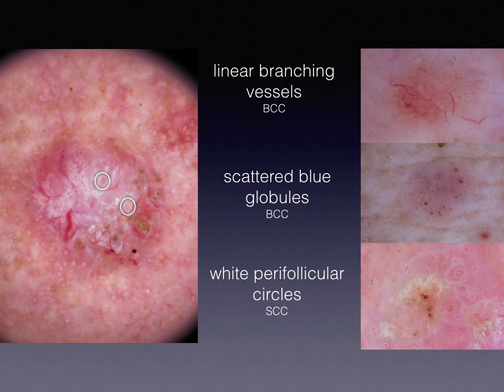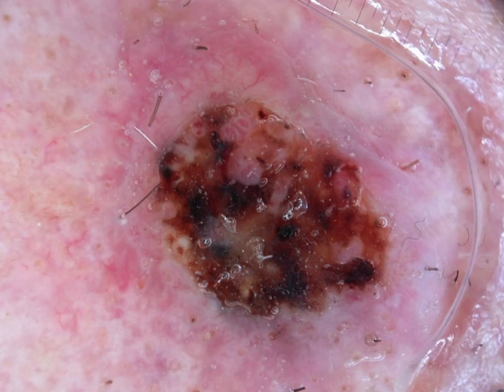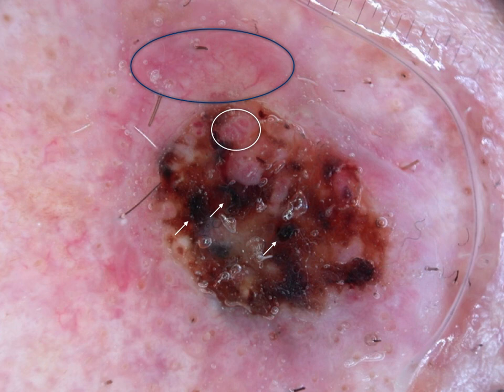One more example: a hyperkeratotic elevated lesion. On dermoscopy, we can see blood crusts — blood in keratin — which is a clue for squamous cell carcinoma. Within a circle, there are also vessels surrounded by white halos, again a clue for SCC. But on the upper part of the lesion, there are completely different vessels — linear, somehow branching — which is a clue for basal cell carcinoma. So again, a combination of SCC and BCC clues.